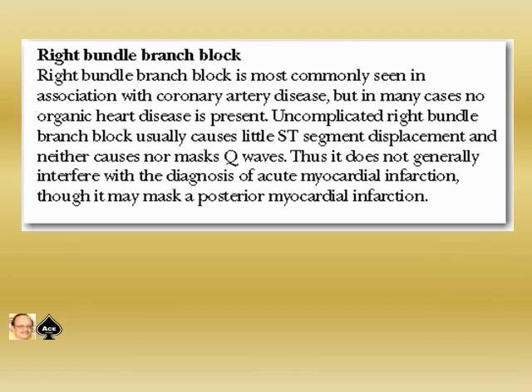Right bundle branch block is most commonly seen in association with coronary artery disease, but in many cases no organic heart disease may be there. Uncomplicated right bundle branch block usually causes little ST segment displacement and neither causes nor masks Q waves. Thus it does not generally interfere with the diagnosis of myocardial infarction, though it may mask a posterior myocardial infarction.